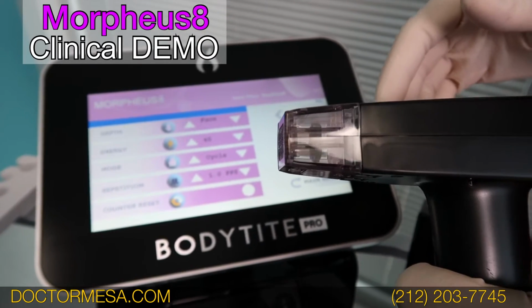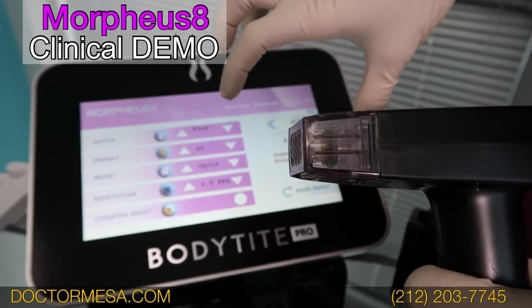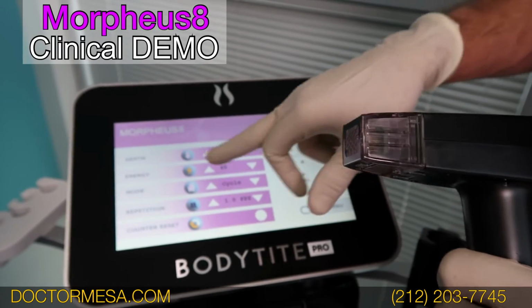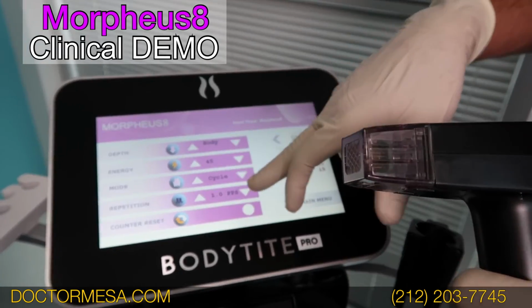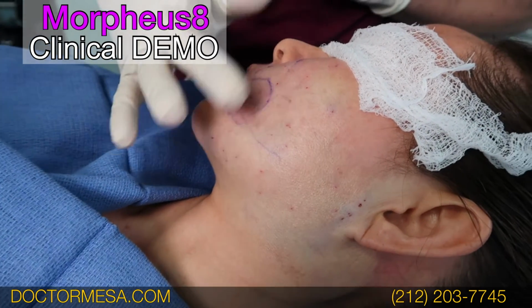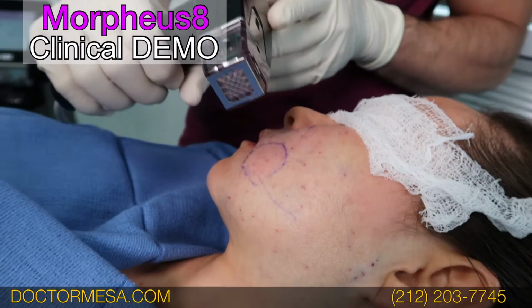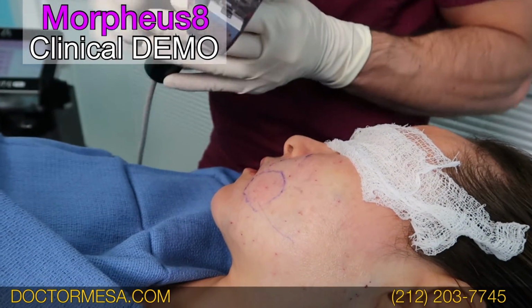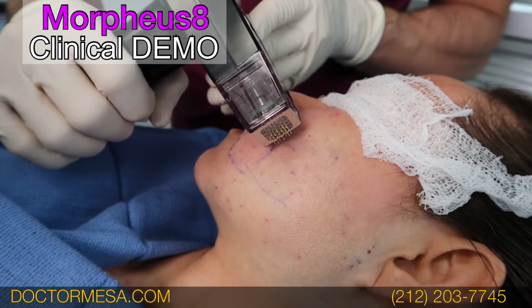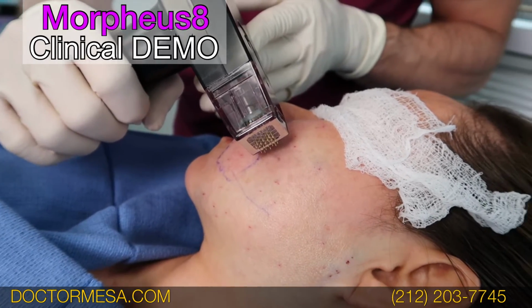So in this patient, we're going to start first with the reshaping of the fat, that is the deep compartment, and then we're going to go superficial with the Fractora mode. So we're going to go to body, 45, and I'm going to do the cycle. So now we have the patient here. She has been anesthetized with local anesthesia. The skin has been cleaned. We have the Morpheus in the body mode. Put it on ready, and as you can see here, the needles are going to start going in and out very deep into the fat to reshape that area.